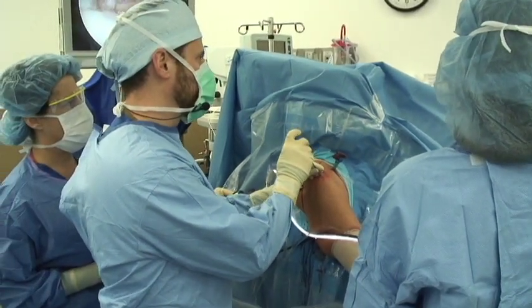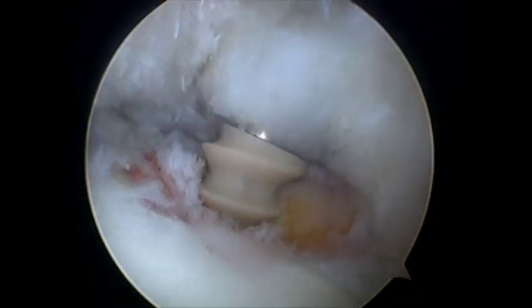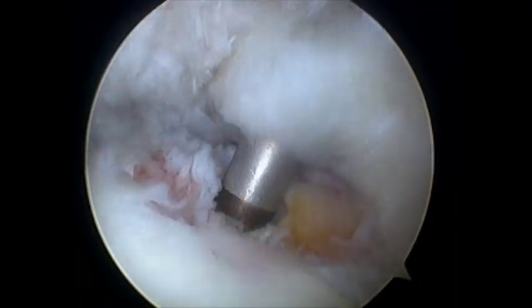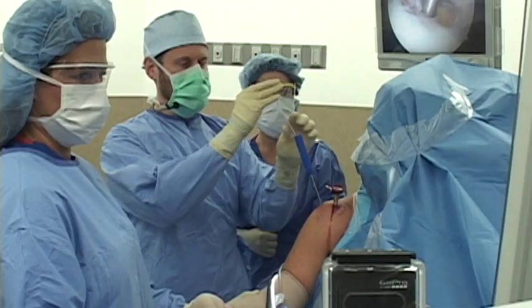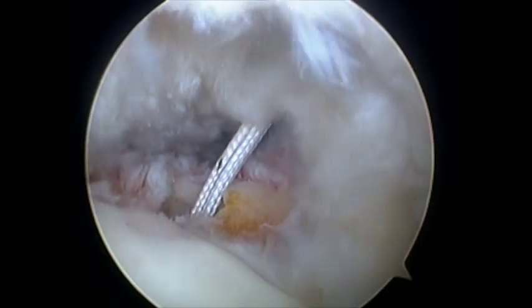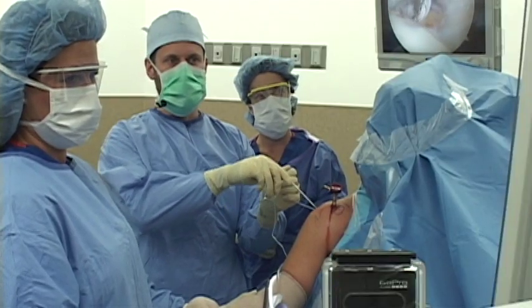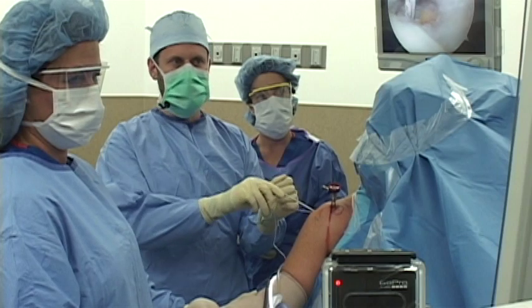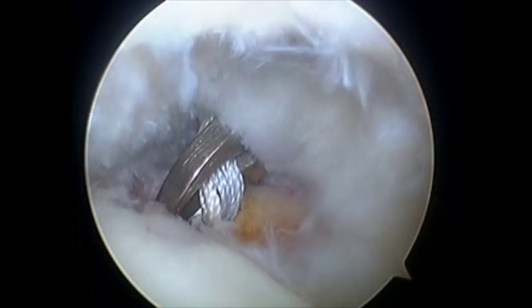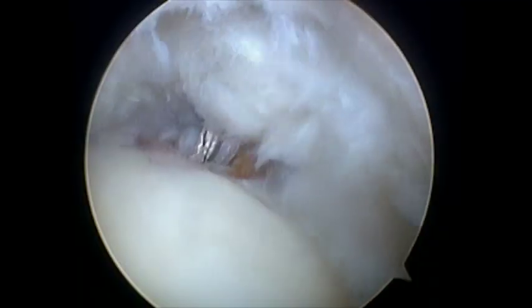Now into that hole we'll put an anchor, which is basically an eyelet screw. That's going to go through this small incision I made into her shoulder. Now that anchor is going into the hole I've made and we're just going to screw it in. When I take the inserter off, what you'll see is that there are stitches attached to that screw. Now I've got these stitches and they're attached to the bone — they're not coming out. We've got an anchor in the bone attached to these stitches, which we are then going to use to tie this torn tendon tissue down.